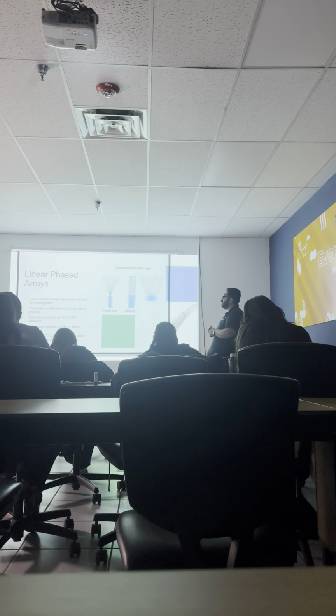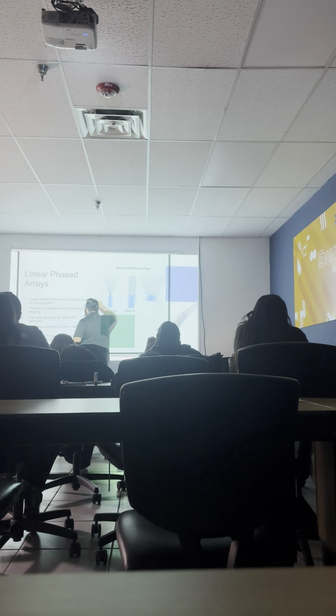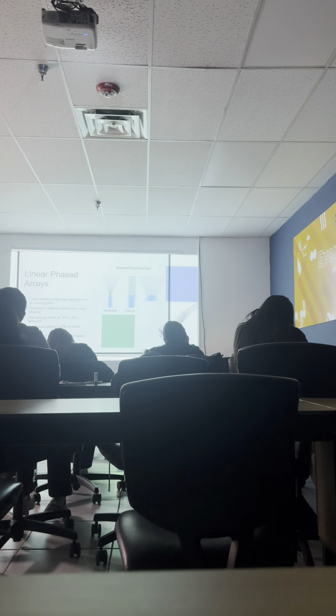A damaged PZT can result in inconsistent beam steering and focusing. This means that if a crystal is damaged, this information is going to be lost. Now, what will it look like on our screen? Blank. It'll be a black line all the way down from top to bottom. If we see that dark artifact from top to bottom in a straight line, there is a crystal that is damaged. So the GE has a crystal that is damaged on the linear probe.